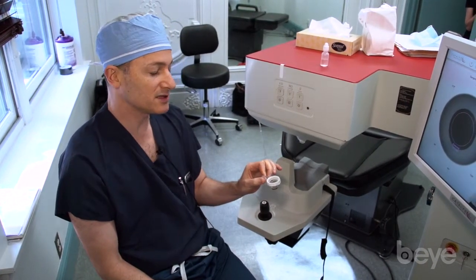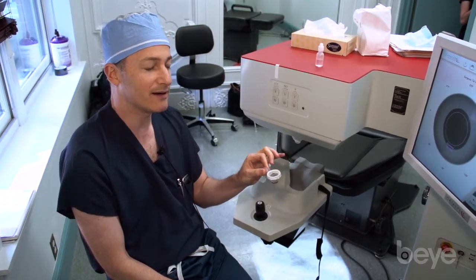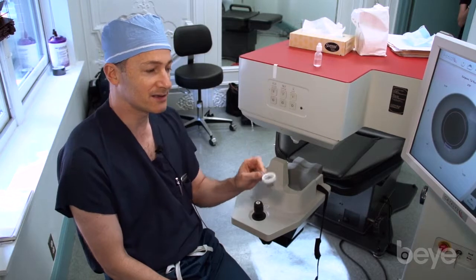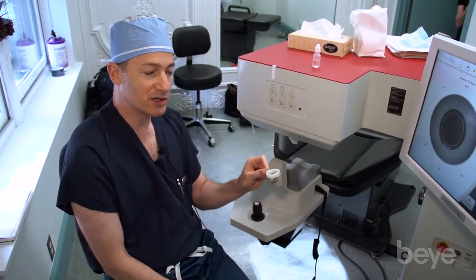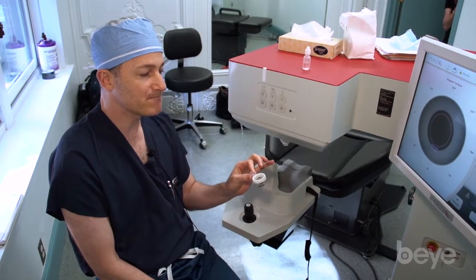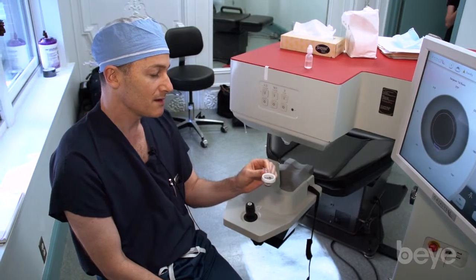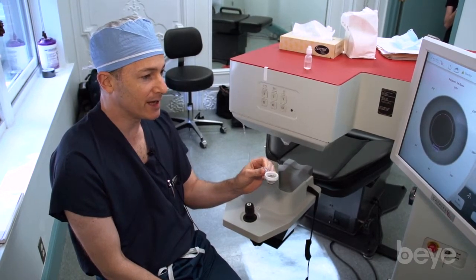Some systems crank up the IOP to hold on very tight, but that has downsides for imaging, patient comfort, and perhaps safety. I think the Catalyst has found a sweet spot, and as long as we keep that in mind and act as good surgeons, we can mitigate the micro-movements that patients have.